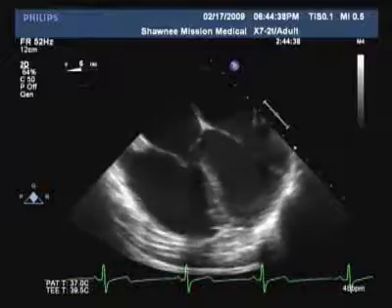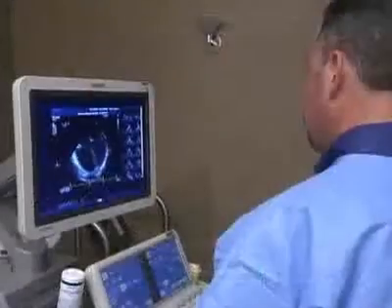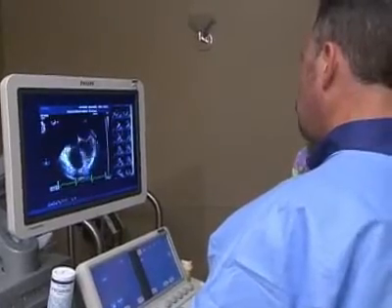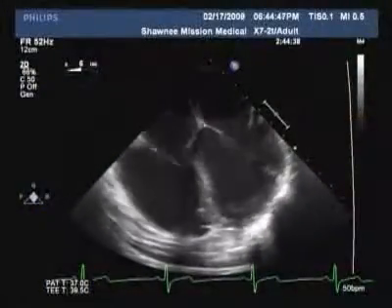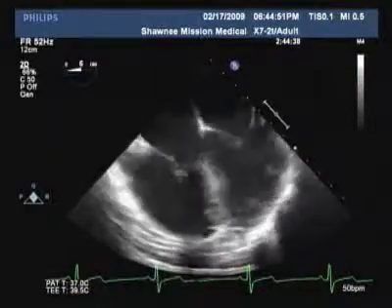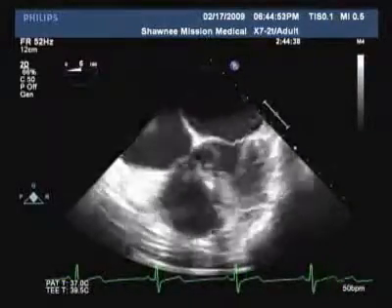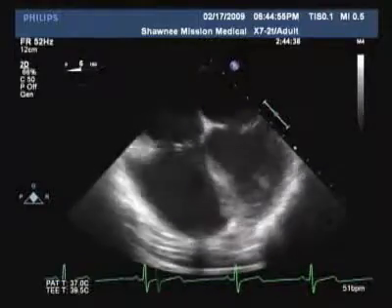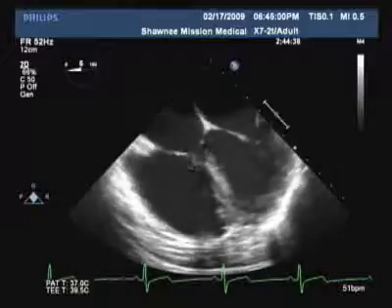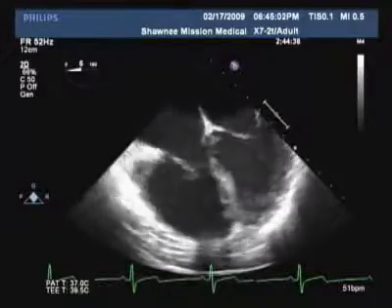I think now we're kind of in what we would typically call a 5-chamber view, which I think is good to see. On the right, on the bottom, is actually the left ventricle again, with the mitral valve up there on the right in the middle, and above that is the left atrium. On the bottom left is the right ventricle, the tricuspid valve, and then the right atrium above that. And every once in a while, you'll see the aortic valve come into play there as well. And this is very nice images, so you can see beautifully.